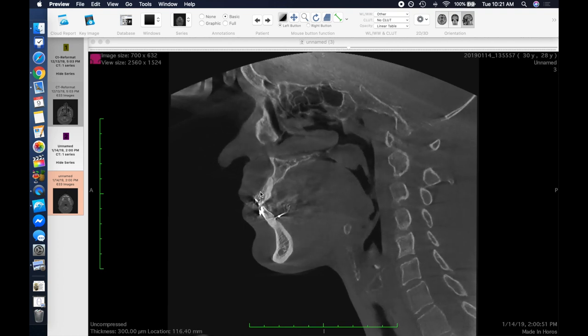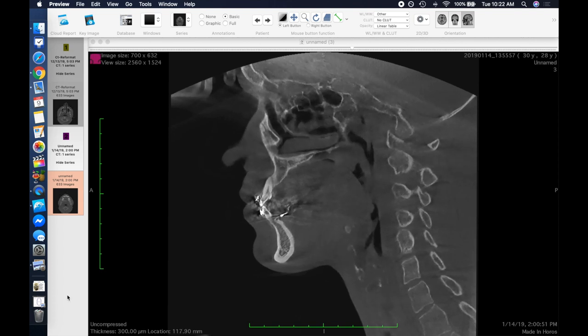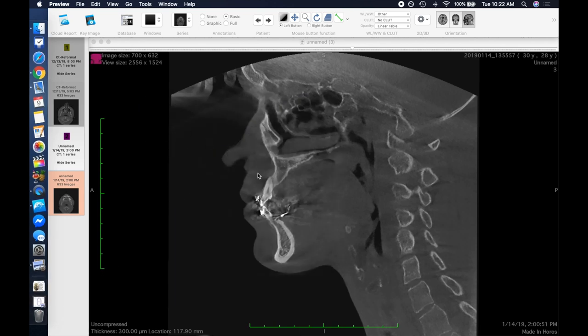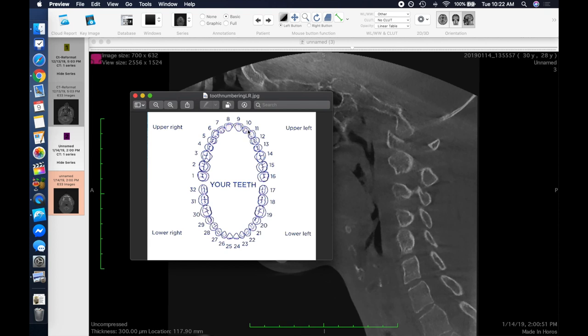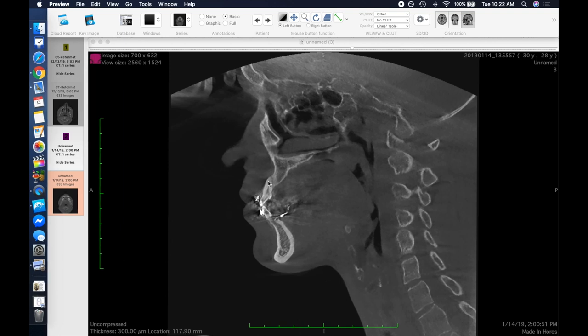Now we're going to proceed to the last tooth in our analysis here. This is going to be tooth number 7. And again, just like tooth number 10, tooth number 7 is the right side analog of tooth number 10. There's nothing in front of this tooth. There's no bone in front of this tooth. Any bone that's there is behind it. There's not even any on the tip of the root.